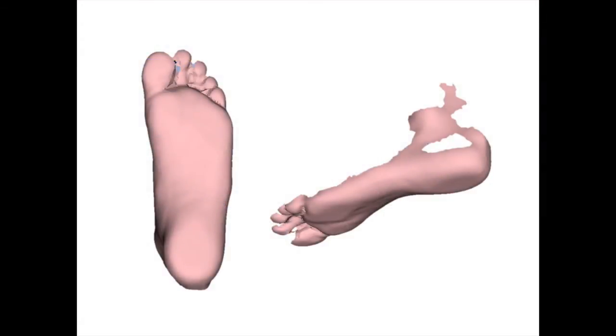Make sure you rotate the image. Look to see that metatarsals 1 to 5 are visible including the surrounding soft tissue.